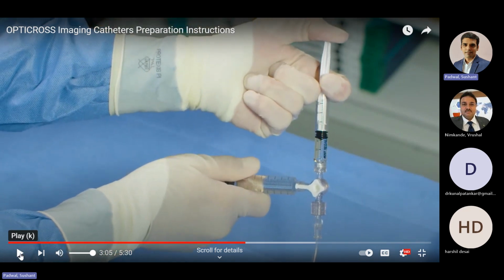Here you can see the operator has done flushing twice with the 3 cc syringe. The main reason behind it is that the total volume of the catheter is 5 cc.